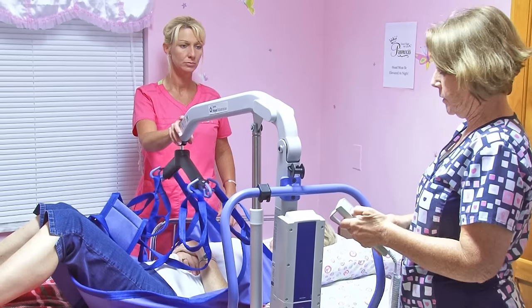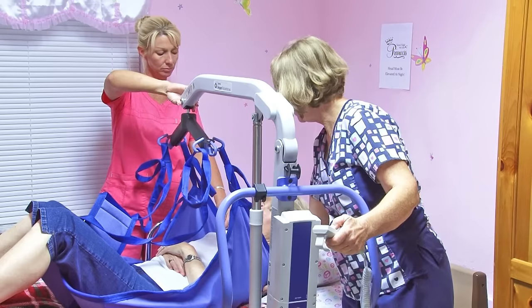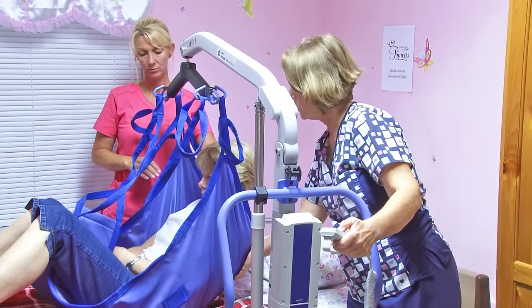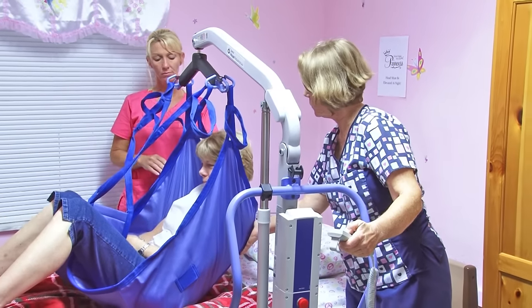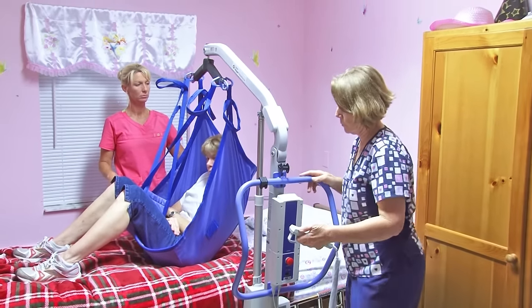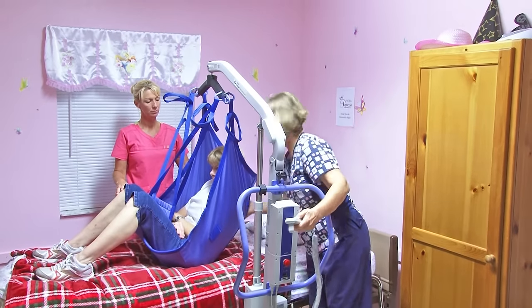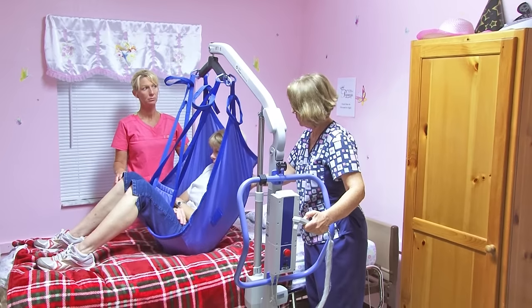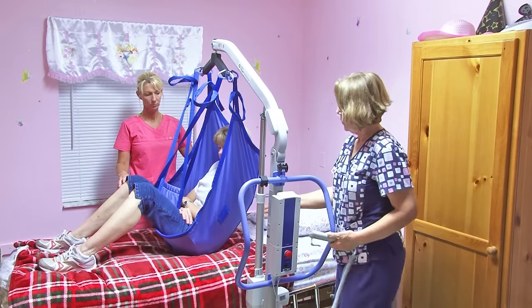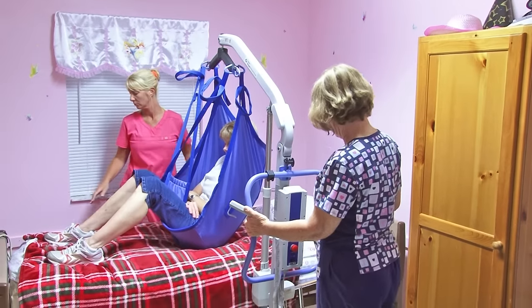Now we're going to raise. We're going to be going up now. You're going in a sling — it's like swinging, like when you were a kid. Is everything okay? We're doing pretty good. Yes, I will continue. In this case, we have to lower the bed a little bit more because we did have to raise it slightly for the leg on the other side.